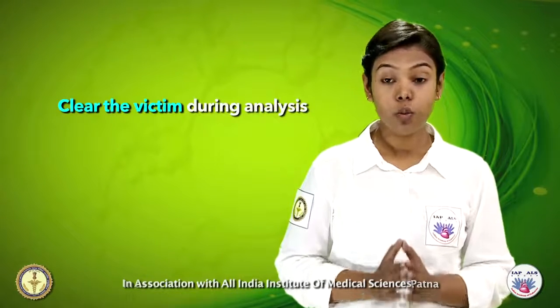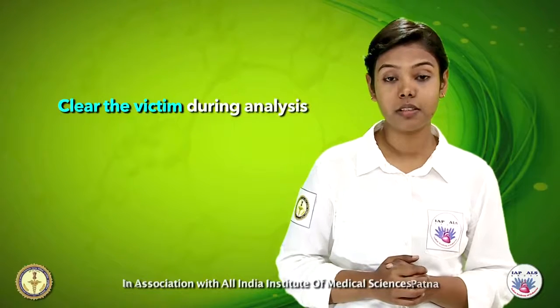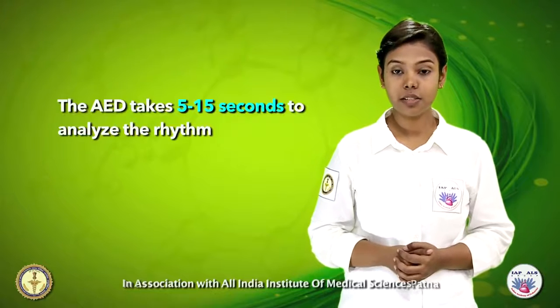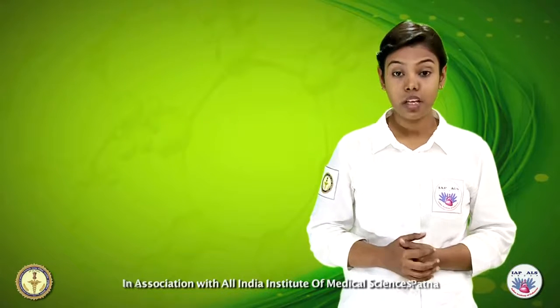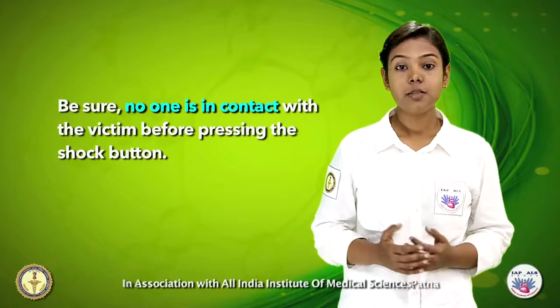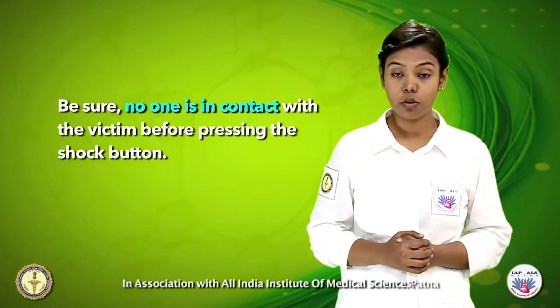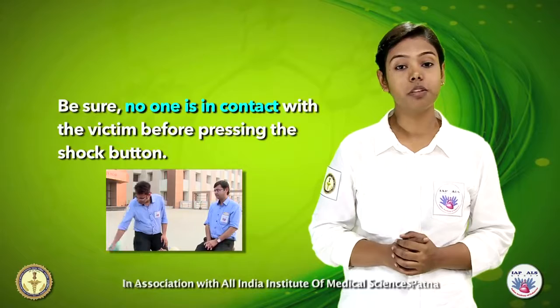Be sure no one is touching the victim, not even the rescuer in charge of giving breaths. The AED takes 5 to 15 seconds to analyze the rhythm and assesses whether a shock is needed or not. If a shock is advised, the AED would also prompt you to clear the victim. Speak clearly and loudly, clear the victim, and look to be sure no one is in contact with the victim before pressing the shock button.